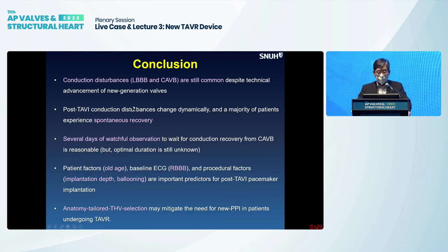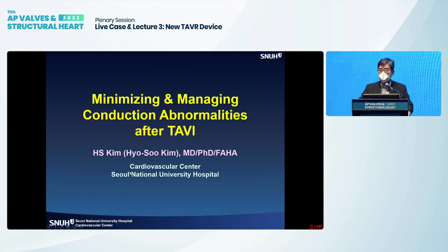In conclusion, conduction disturbances are still common, but most of them showed spontaneous recovery. Several days of watchful observation may be reasonable. Old age, RBBB, implantation depth, and ballooning are risk factors. Anatomy-tailored valve selection is recommended. Thank you very much for your attention.